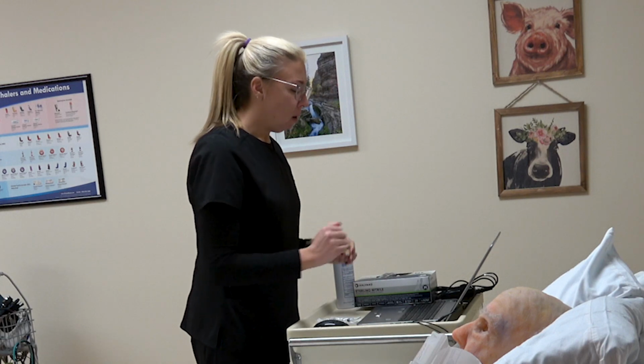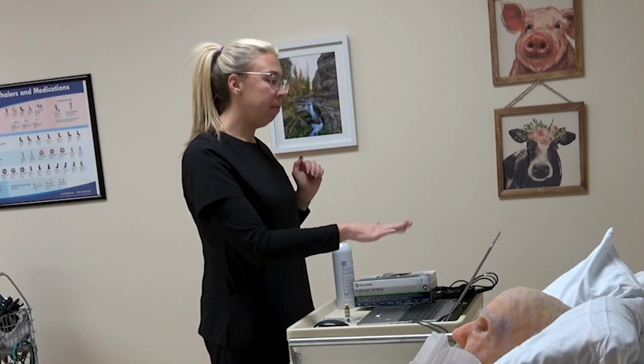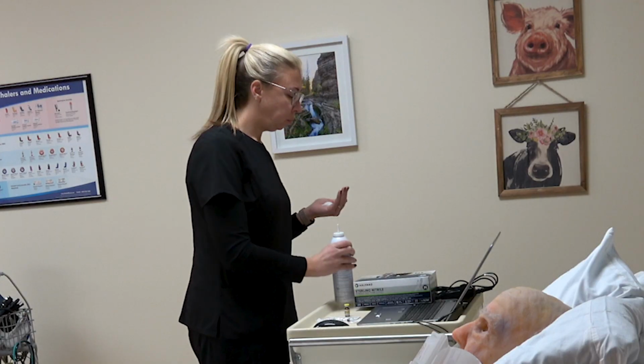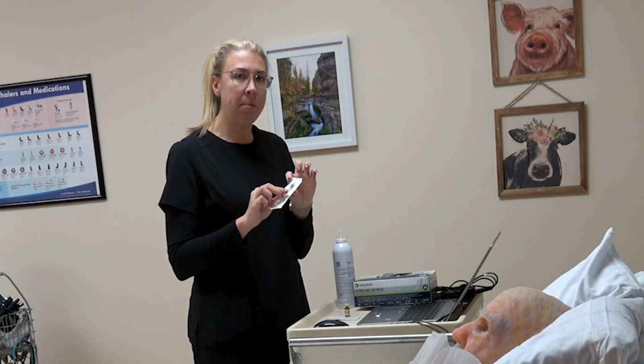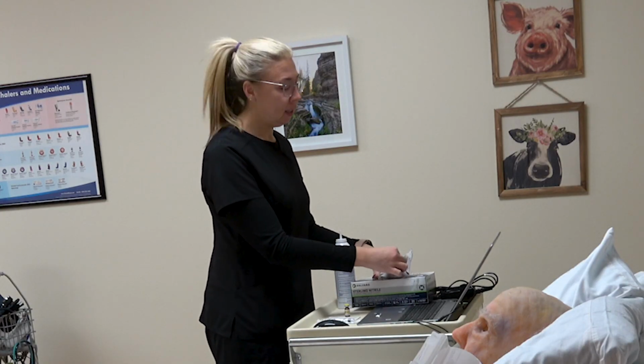So it looks like we have all of our correct medication here. I'm going to go ahead and draw up my medication at the patient's bedside while verifying on the MAR. So I'm going to do hand hygiene again. And if you were to prepare this medication away from the patient's bedside, you would need to label your syringe with the medication, dose, patient name, date of birth, and the date and time that you drew it up. But preferred method is at the bedside.